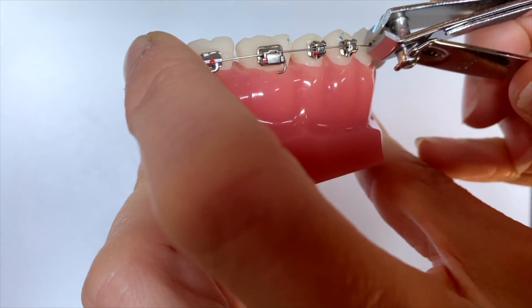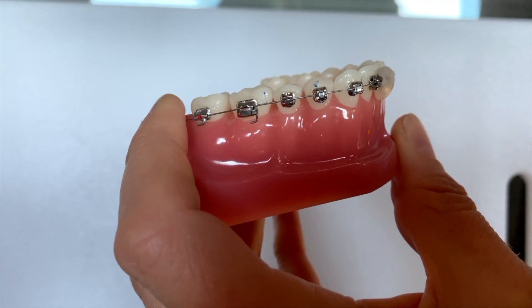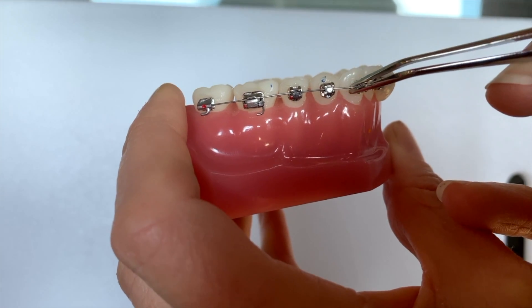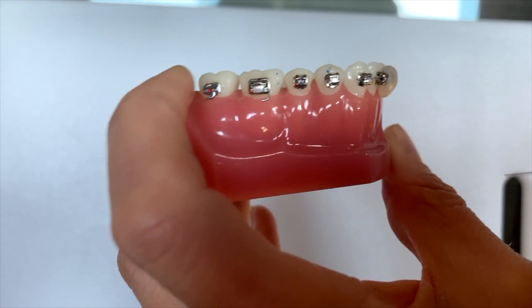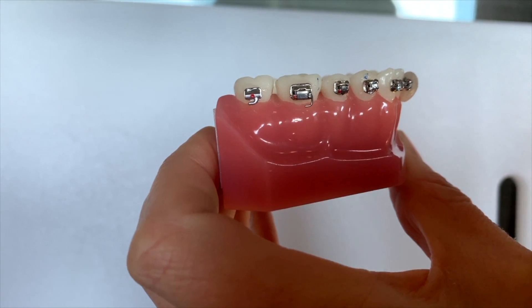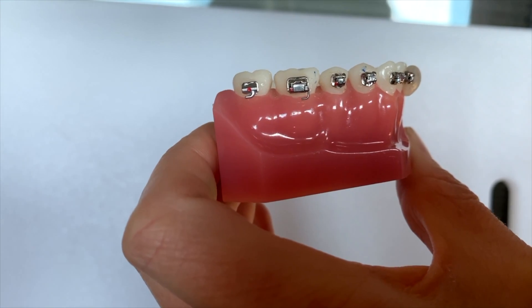These nail clippers might not be the best ones. Once you have that wire trimmed like that, you can grab with your fingers or tweezers and just literally tease and pull that wire right out of the slot. Then you won't be dealing with that pokey wire out the back. Once we reopen, we can absolutely get a new wire back in there. So this is another option if you simply can't get all the way to the very back of the mouth.